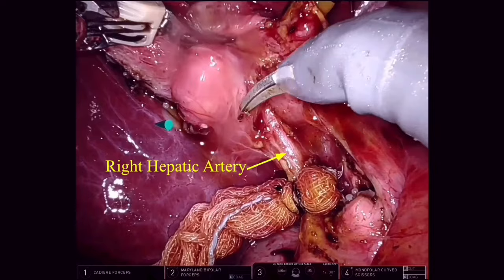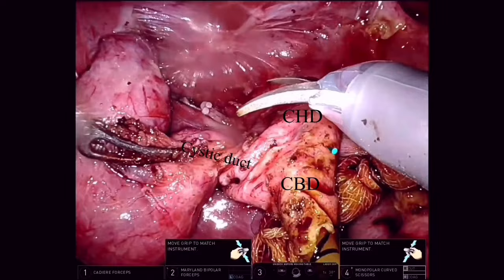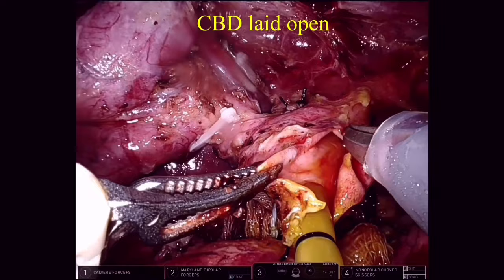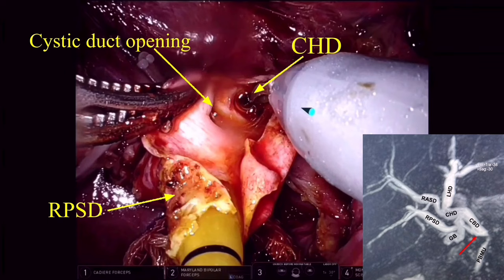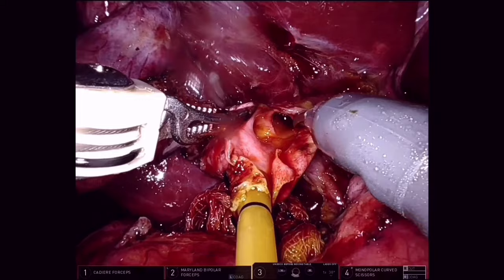The cystic artery is then dissected in the Calot's triangle, clipped and divided. We intermittently use ICG for biliary mapping. The common bile duct is then slid further and we see three openings: the cystic duct opening into the common bile duct, the common hepatic duct, and the aberrant opening. The aberrant duct is running on the posterior lateral wall of the cystic duct and the common bile duct.